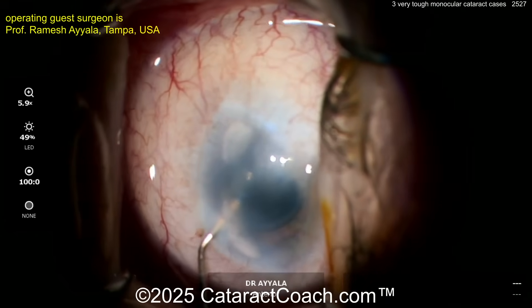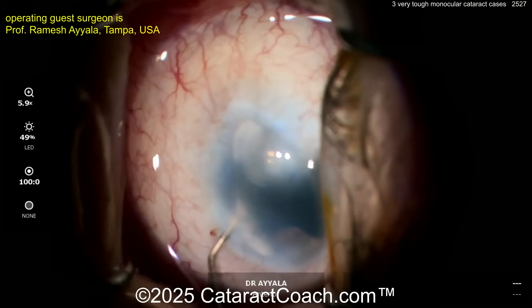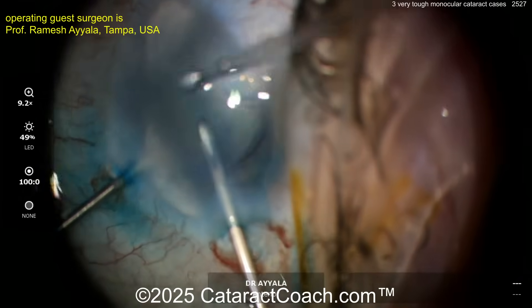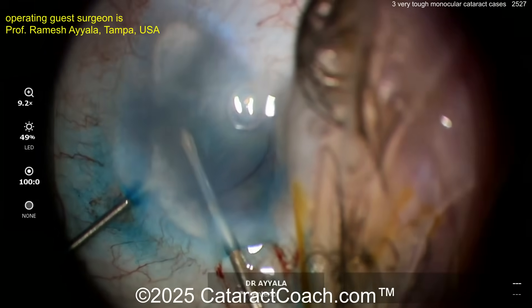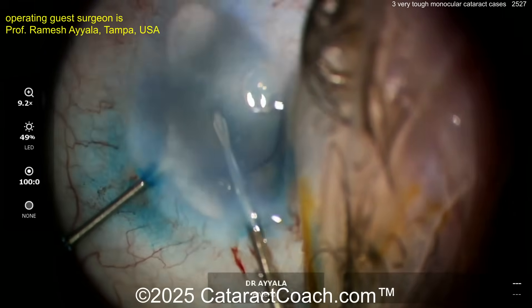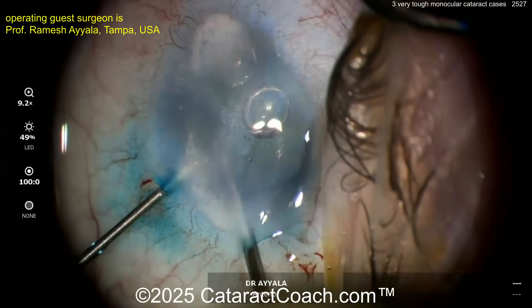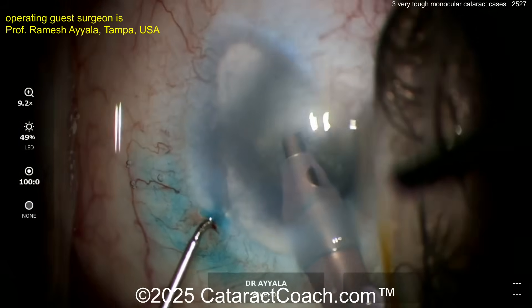This is just so stressful. Going to put a little bit of trypan blue dye to get a stain. The stress is on — this is the patient's only eye. Here comes the incision made temporally, which is kind of the only part of the cornea that looks reasonably normal. Now trying to get the rhexis done — be careful of zonulopathy. Remember, these tiny nanophthalmic eyes have a much higher rate of zonulopathy. Maybe here's where an endoilluminator may be helpful as well.